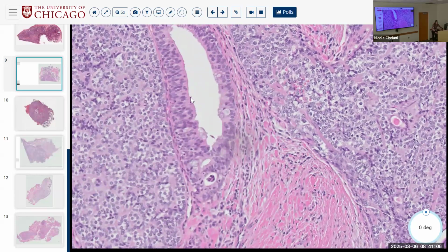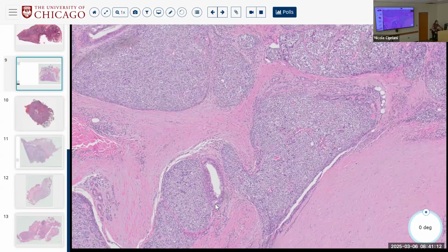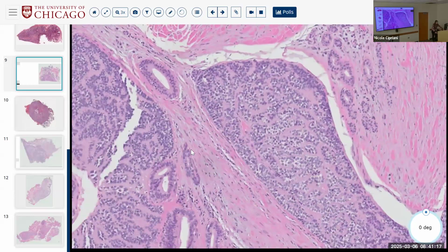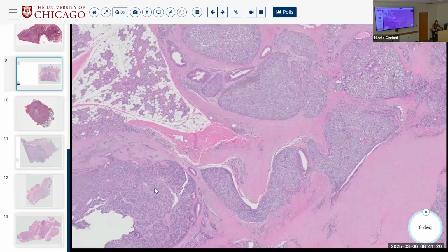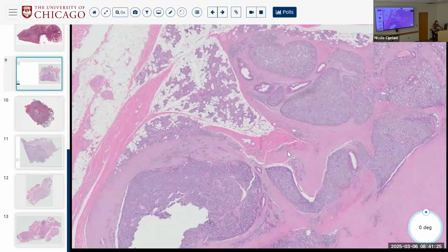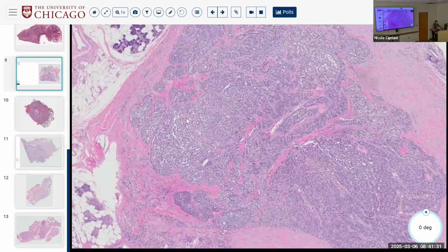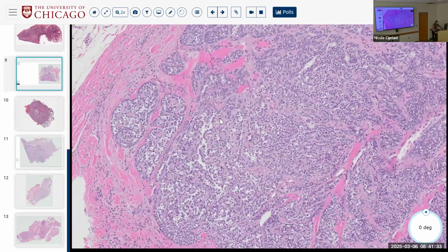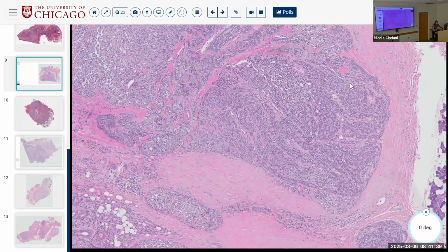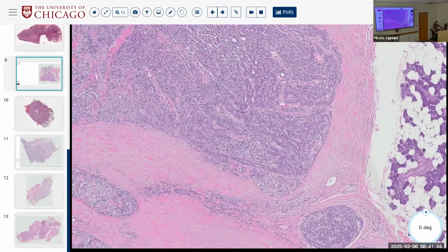So you have a nice kind of ciliated thing with inflammatory debris. So probably an entrapped duct, just like maybe some entrapped over here. All right, but the tumor is sort of laying down this pink stroma. And if we look carefully, do we think that this is monophasic or biphasic? This one's a little hard to tell.